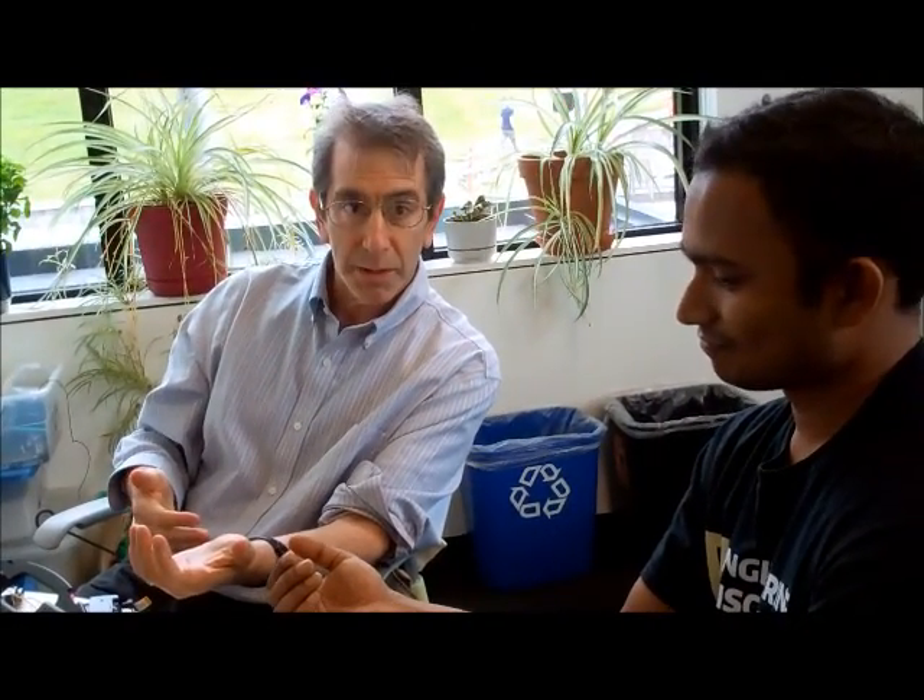I'm connected to EMG, which is inputted into the device, which will then turn on the nerve stimulator. That has been preset to get a response from this muscle, from this hand. So we'll demonstrate that right now.